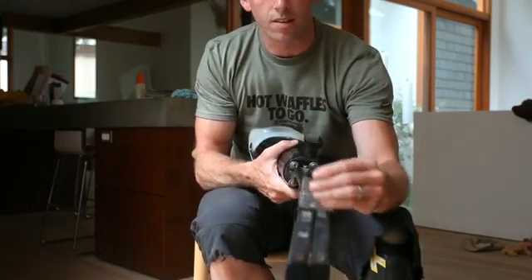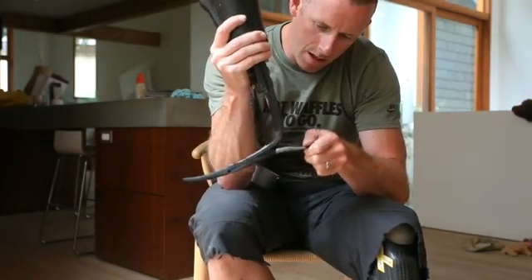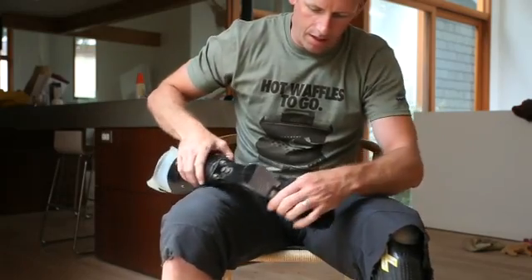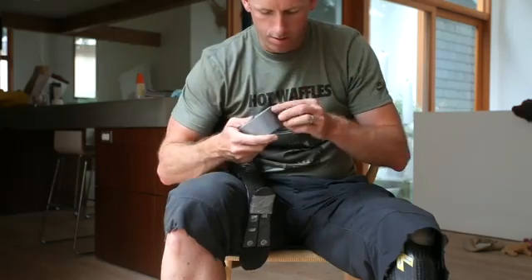Now the next thing we want to prevent is the up and down movement that's going on, because that's not any good either. My plan for that is also duct tape.